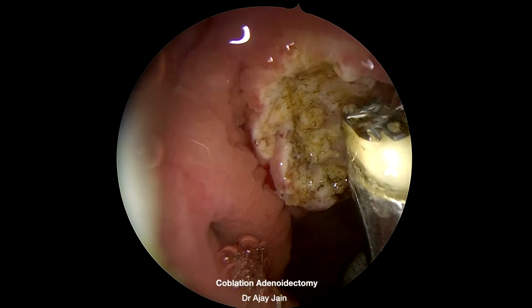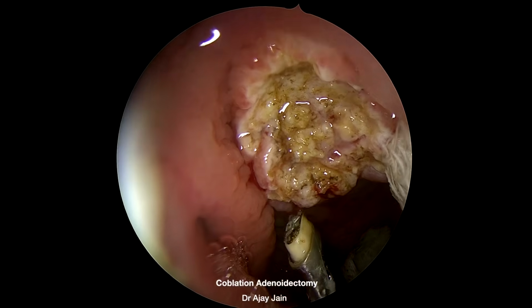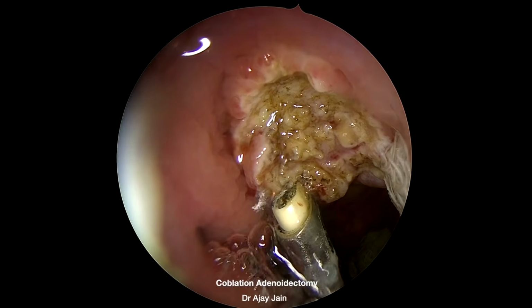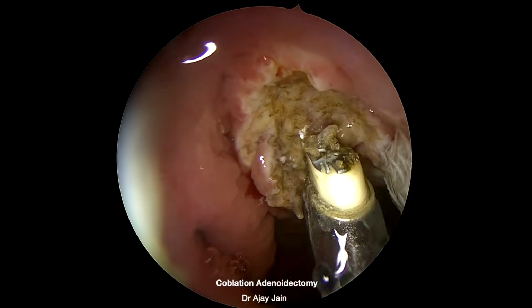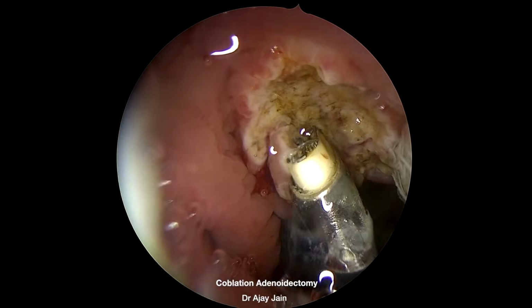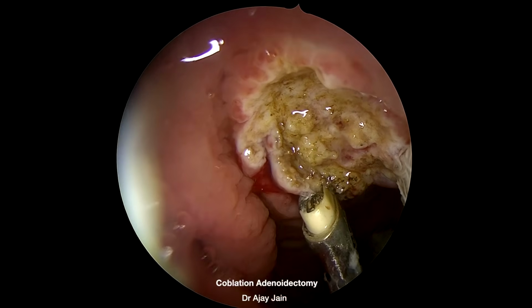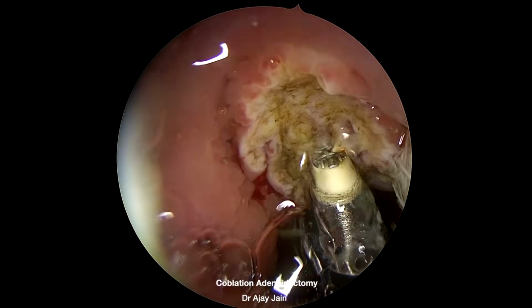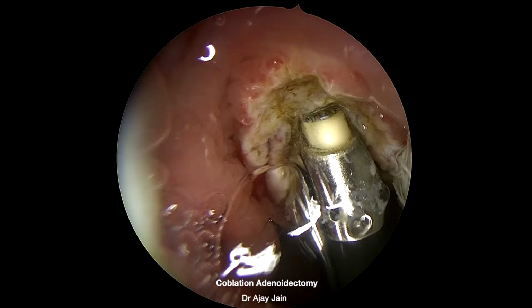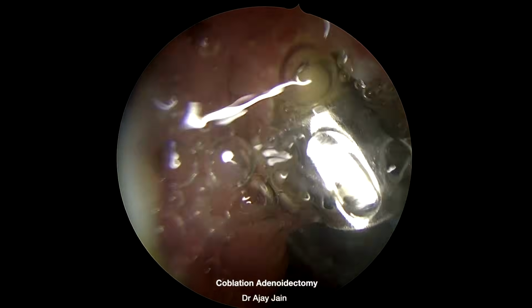This is a very satisfying operation. The surgical field remains almost bloodless, as you can see, and there is minimal thermal injury, which usually translates into significantly less postoperative pain. The aim is to complete as much of the surgery as possible during a single passage of the nasal endoscope. Repeated insertion and withdrawal of the telescope unnecessarily traumatizes the nasal mucosa.